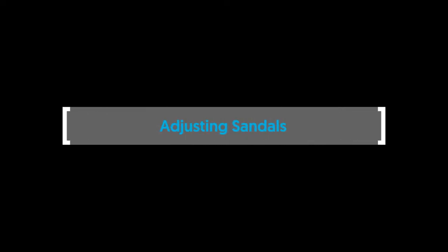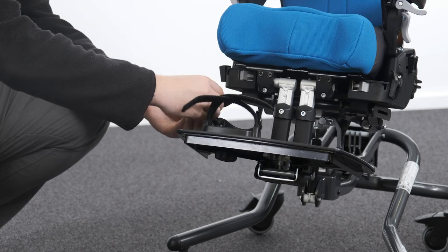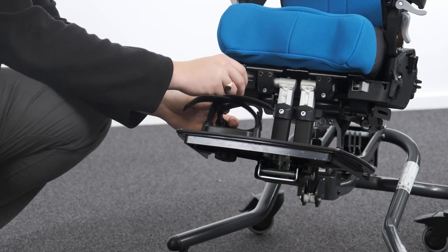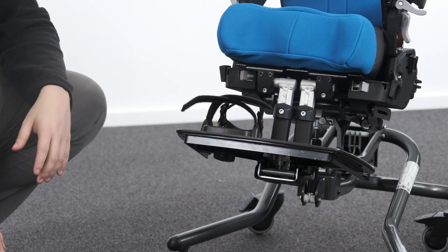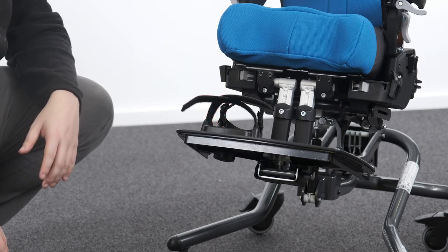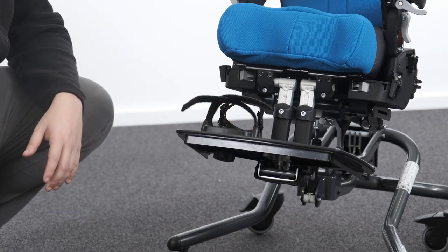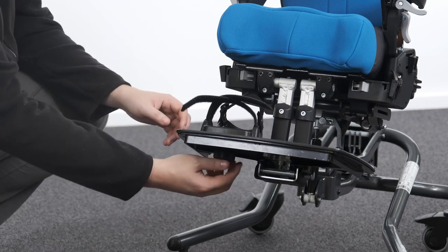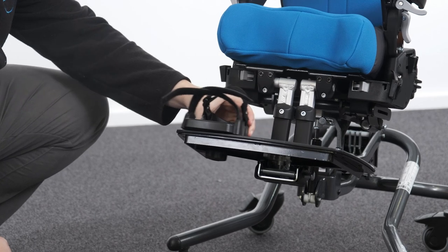Adjusting sandals. To position the user's feet in the sandals, secure the velcro straps provided so the foot is held in place. The strap should be placed over the bridge of the foot and over the toes. The front strap can be fed through one of two slots on either side of the sandals, depending on the size of the user's feet. To adjust the sandal position on the footplate, loosen the knob and move to the desired position. Tighten the knob to secure in place.